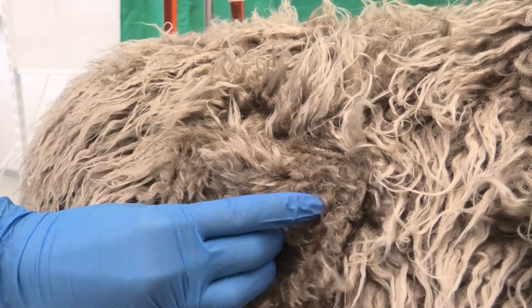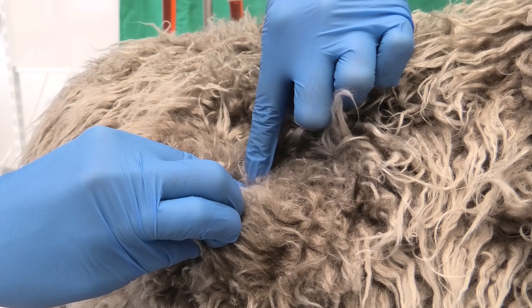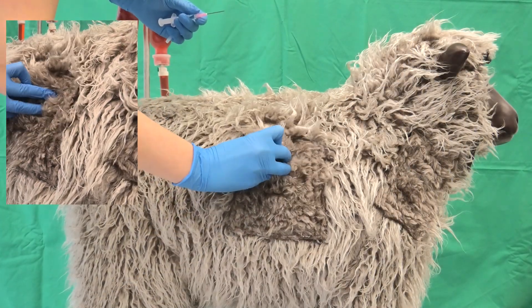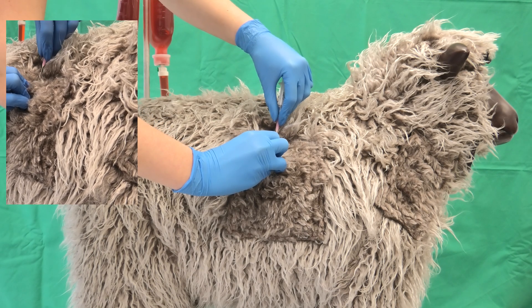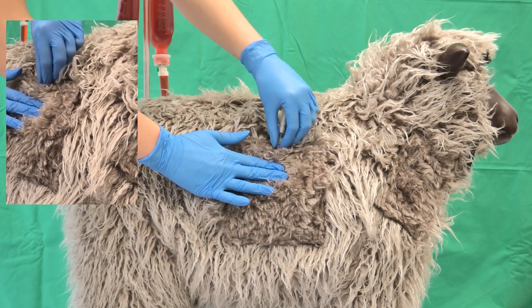A fold of skin is grasped at the chosen location using the three finger grip. The skin is punctured at a shallow angle of 10 degrees to the animal's body, placing the cannula into the created pocket. The bevel of the cannula is always pointing away from the animal. The correct placement of the cannula can be checked by moving the cannula under the skin from side to side.